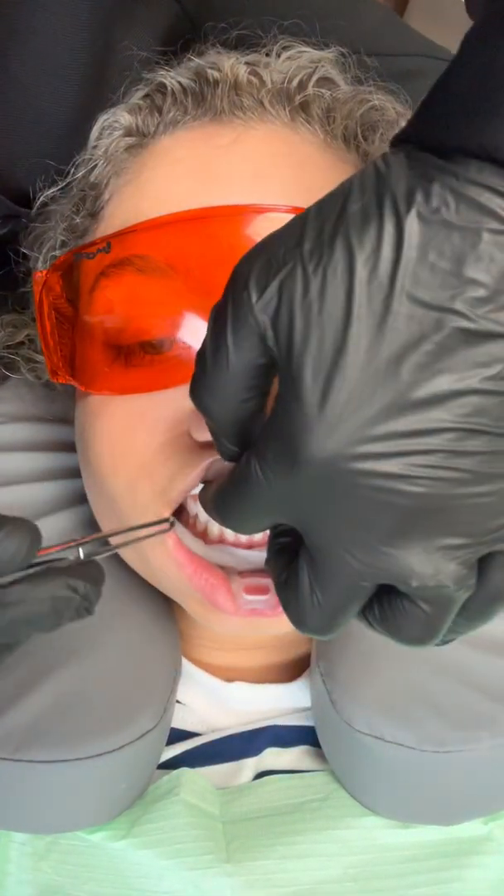Now I'm going to be placing the gingival barrier, and I'll show you here in just a minute exactly how we're going to make sure that it is isolated and attached to the two-by-two. So let's move forward with that. What I'm going to do first is usually take three teeth at a time as I'm placing the gingival barrier.